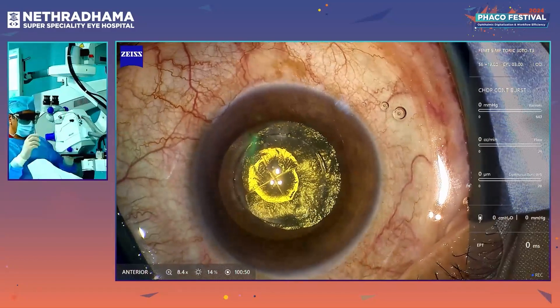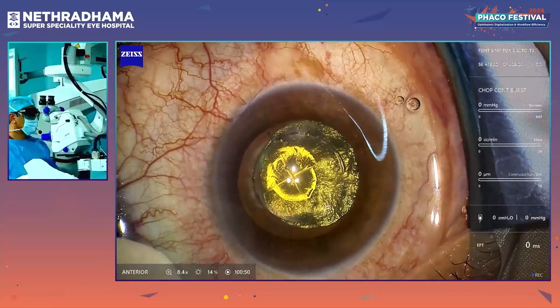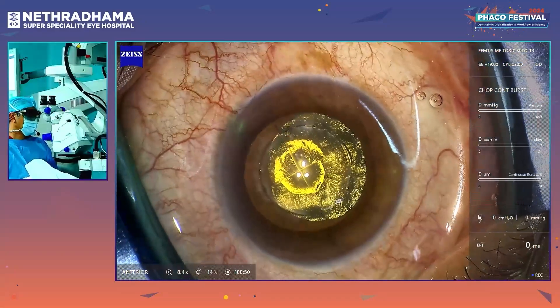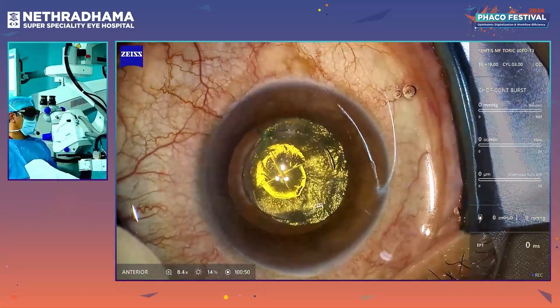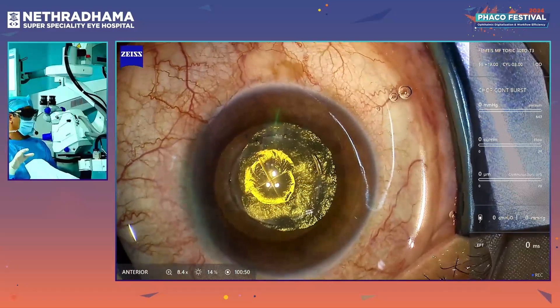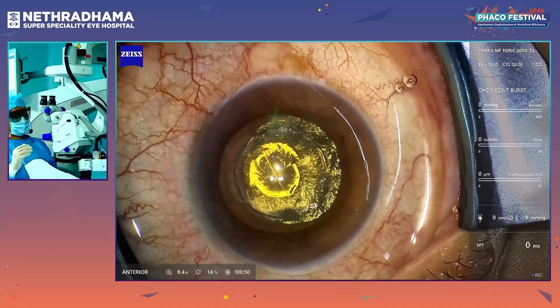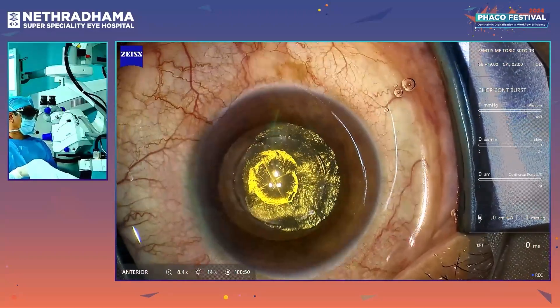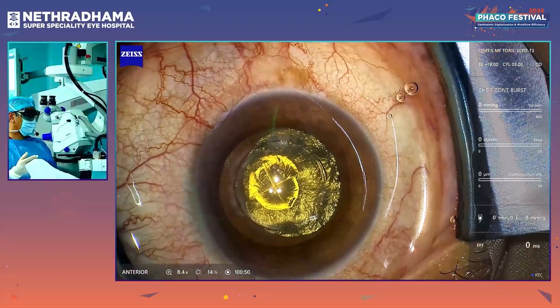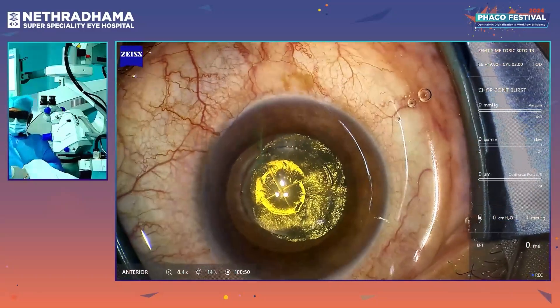Good afternoon everybody. We are going to go ahead with the surgery. We have done the femto laser on the Lens AR system, which I routinely use for my femto cataracts. The advantages are you can have the laser in your ward — you don't need a separate room. It also has a direct connection with the Pentacam, so it does the incisions depending upon the corneal astigmatism. It also calculates your toric axis for placement and makes the nubs in the capsulotomy, known as the intili axis.